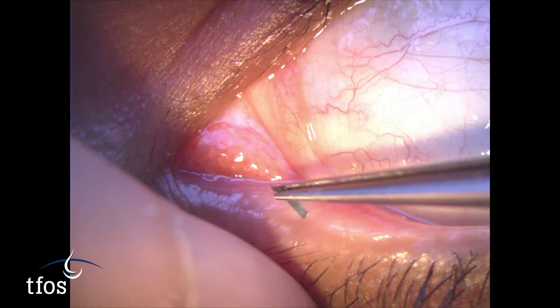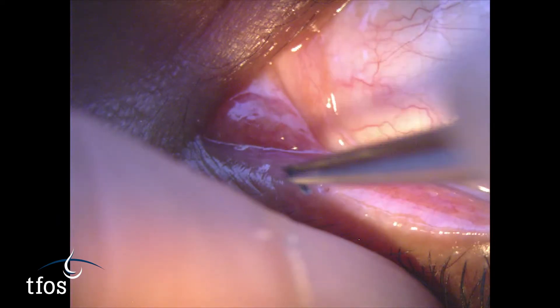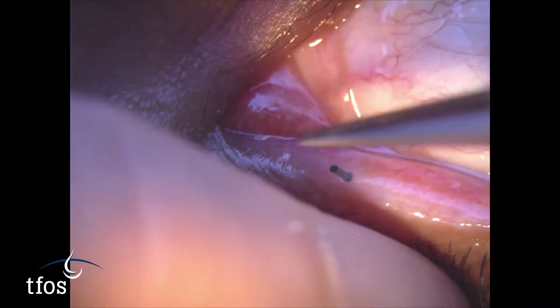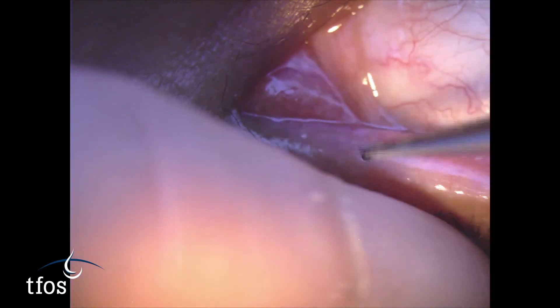The plug is grasped in forceps and positioned in the dilated punctal orifice. For collagen plugs, or for synthetic absorbable intracanalicular plugs, any portion of the plug that remains protruding from the punctum should be tapped into place so that the tip is below the punctum to avoid subsequent irritation.